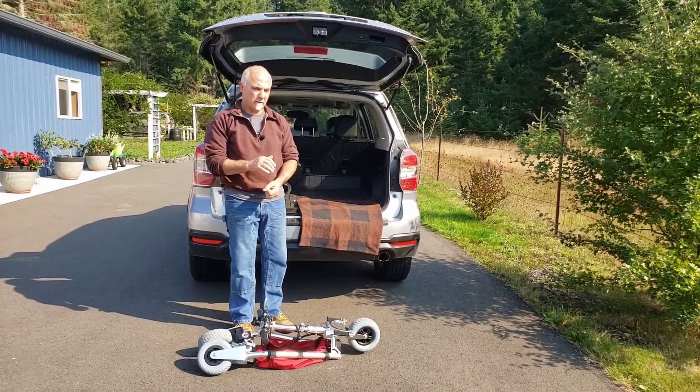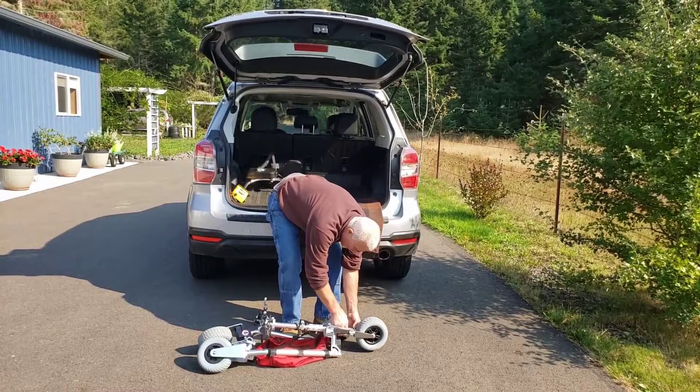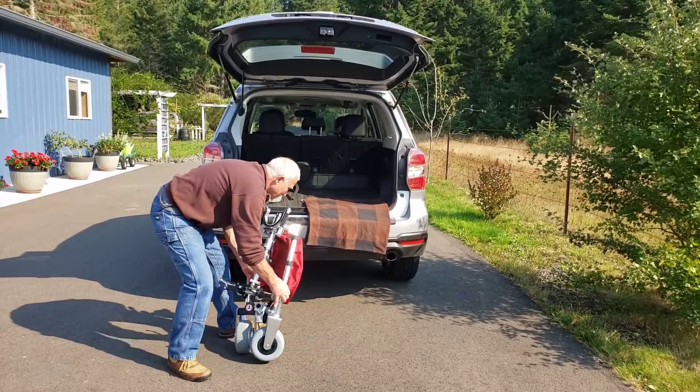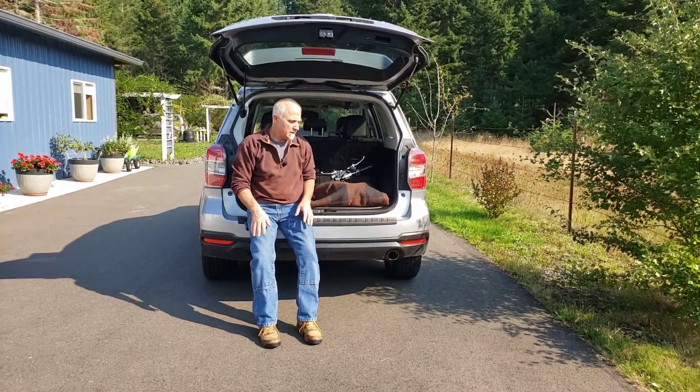In some cases you're going to have an even smaller vehicle. The most compact and lightest way of loading the scooter is to remove even the front wheel. Now you're down to a total weight of 21 pounds. You can essentially slide the scooter up over the bumper and into the vehicle again without too much strain.